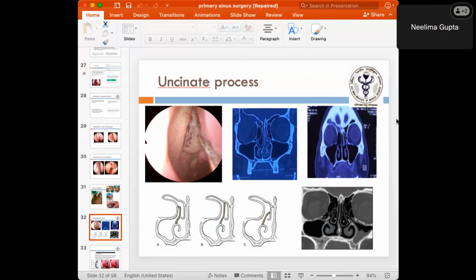So it is important to understand these three passes because this is the standard terminology that we use. Reporting any abnormalities in any of these passes is the standard procedure now. So everyone should report any pathologies in these passes only: first pass, second pass, and third pass.